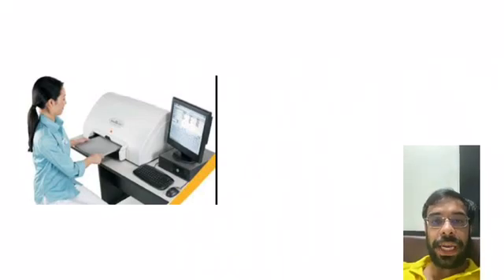Therefore, the CR plate was removed from the table, put in the scanner, red light was given, and the image shows wherever X-rays were attenuated. Now all electrons from the forbidden area will not be eliminated by the red light. Therefore, we give white light and clear whatever electrons remain. Now the CR plate will be ready for shooting another X-ray, like a chest X-ray.